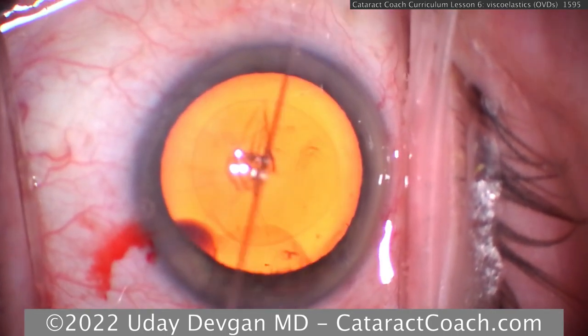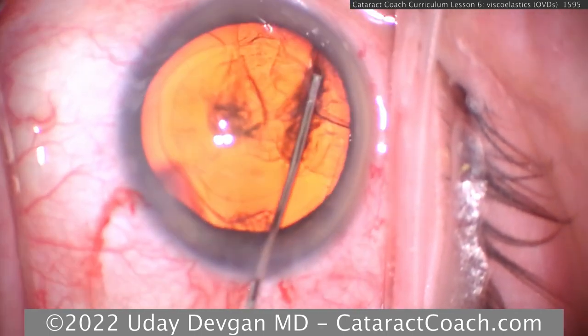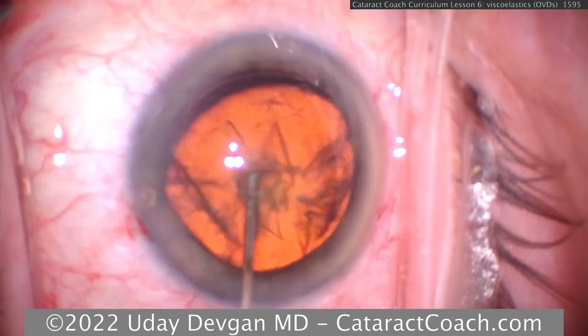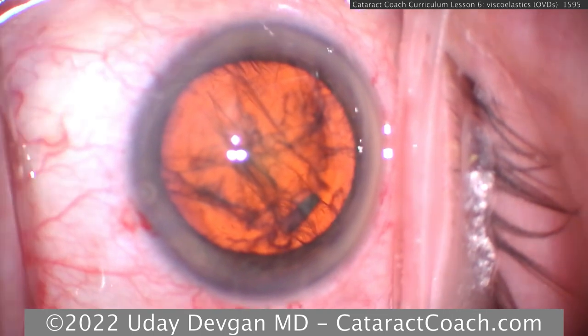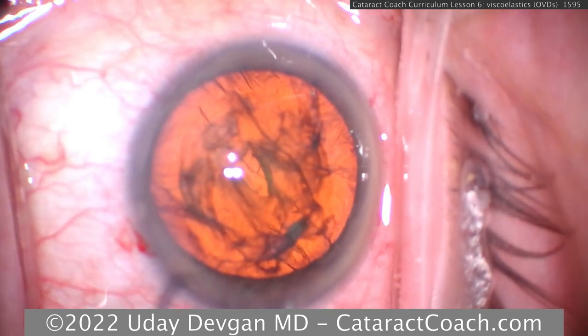The downside to dispersive OVD is that it's not as good at maintaining space within the eye, and it can be more difficult to remove at the end of the case. Examples of dispersive OVDs include VisCoat from Alcon, EndoCoat from Johnson & Johnson, and OcuCoat from Bausch & Lomb. Note that they all have the word coat in the name, since these dispersive viscoelastics coat the eye like honey.